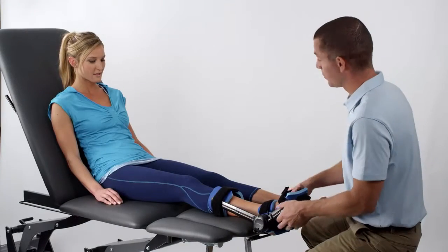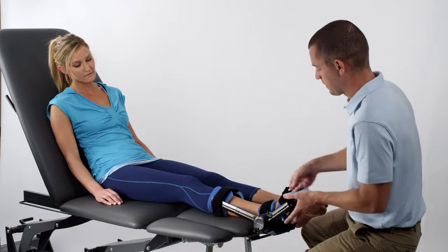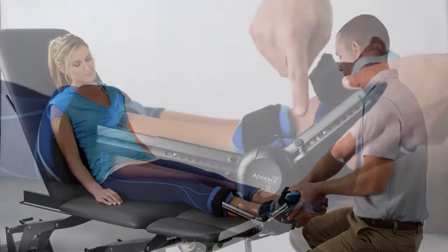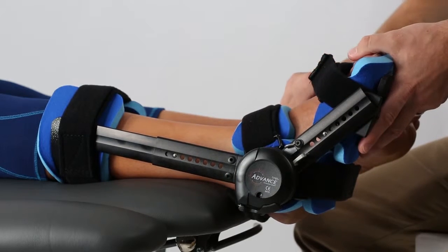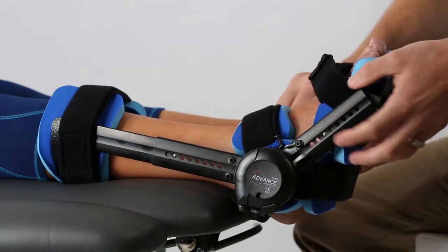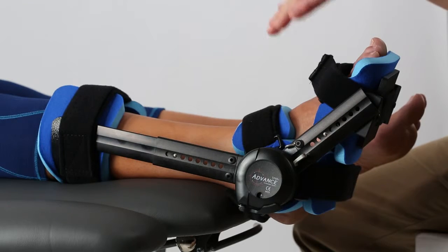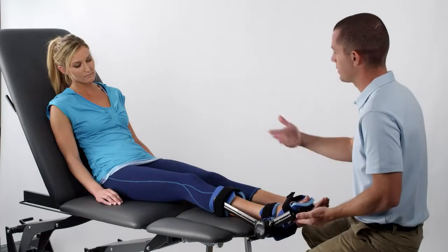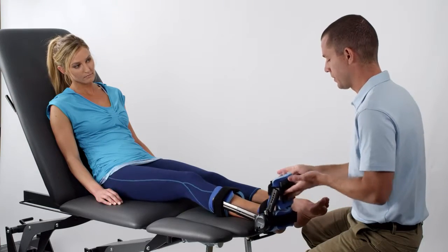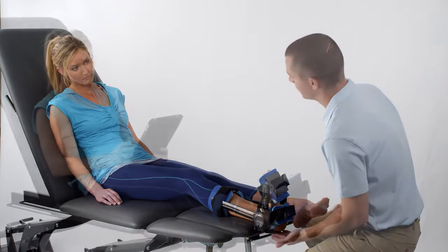With the device secure and properly adjusted, the next step is to place the device into dynamic mode. First, disengage the lock lever safety by swinging it away from the lock lever. Then apply a slight force on the strut to disengage the lock lever. The ankle orthosis now provides a dynamic stress on the ankle.